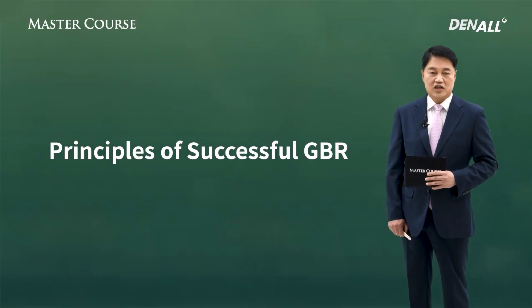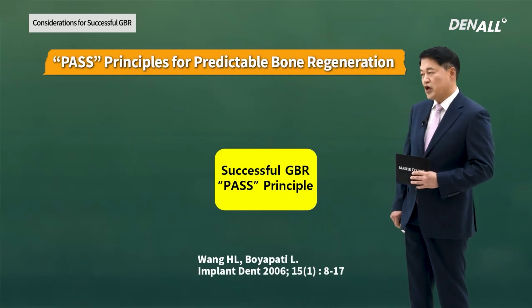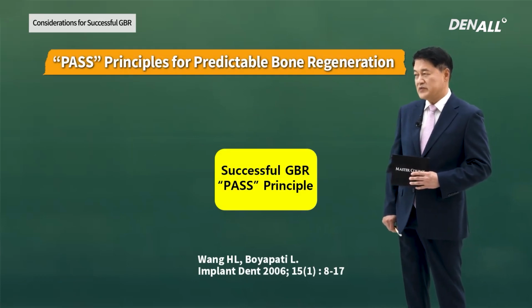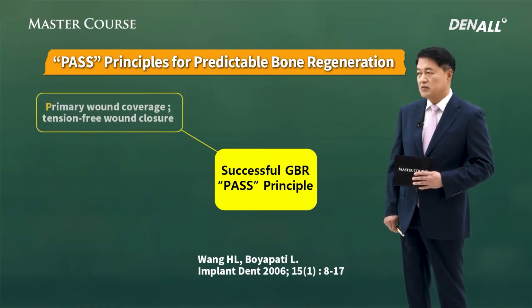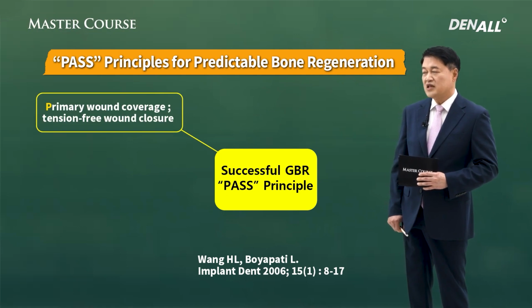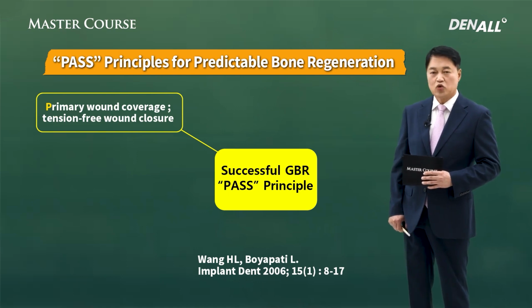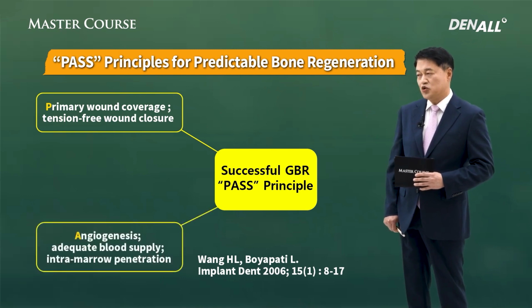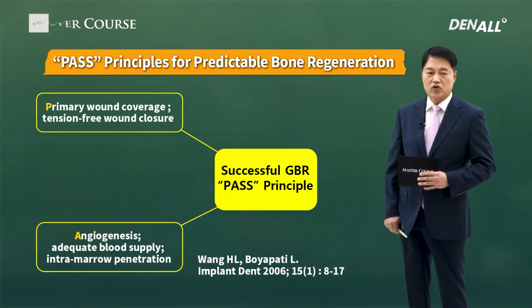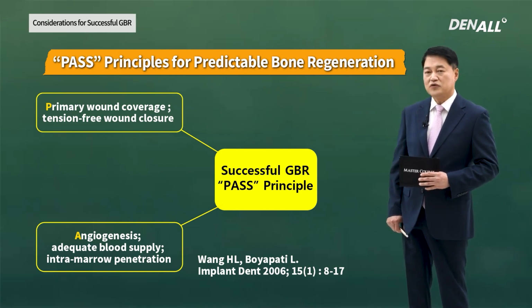Let's look at the principles for successful GBR. In 2006, Wang and others came up with the PASS principle for successful GBR. The first P stands for primary wound coverage. In other words, with tension-free suture, you get primary wound coverage, and that is a condition for successful GBR. A stands for angiogenesis. In other words, adequate blood supply is necessary. And if necessary, intramarrow penetration should be conducted.